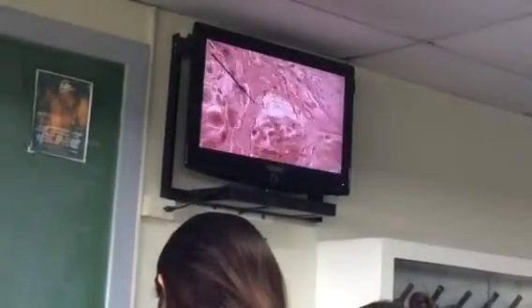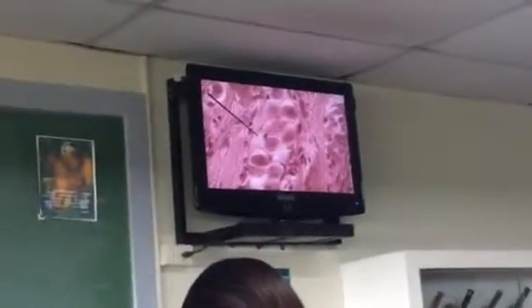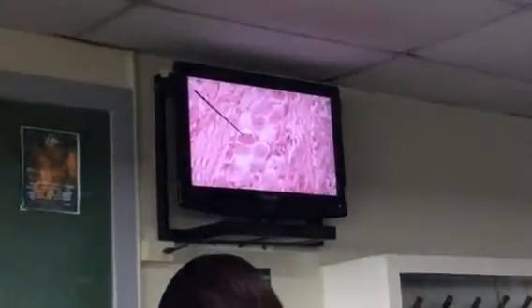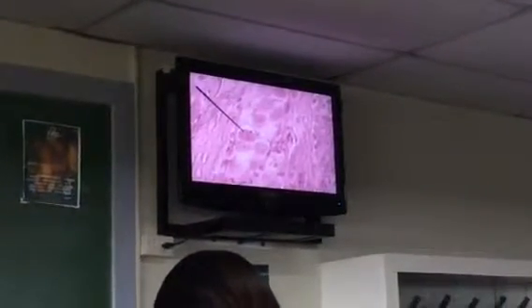As we go further laterally, we'll be able to identify this group of cells. There you go, point large at that. These are actually ganglion cells. Look at that. You know? These are nerve cells. We've already seen ganglion before. Ayan po, di ba? This is now your spiral ganglion. Ganglion cells of your spiral ganglion. Okay? So those are the things you're supposed to identify in your cochlea.